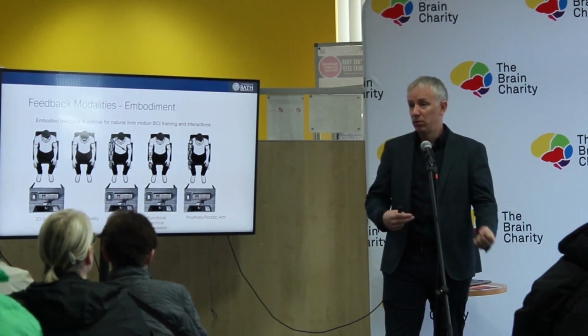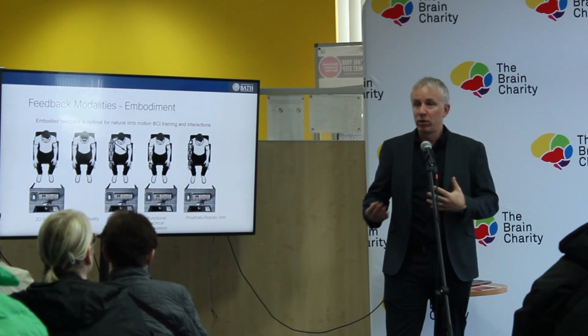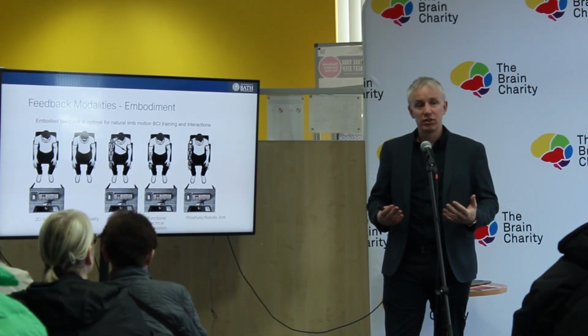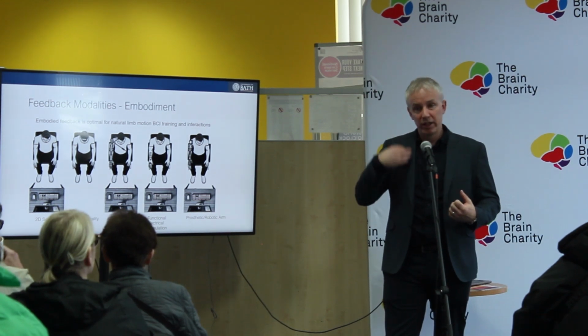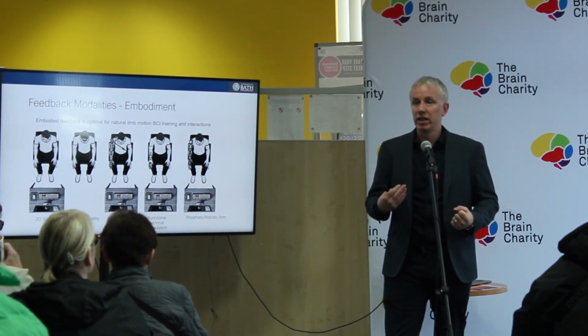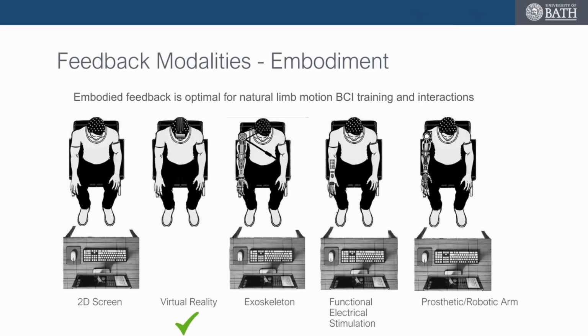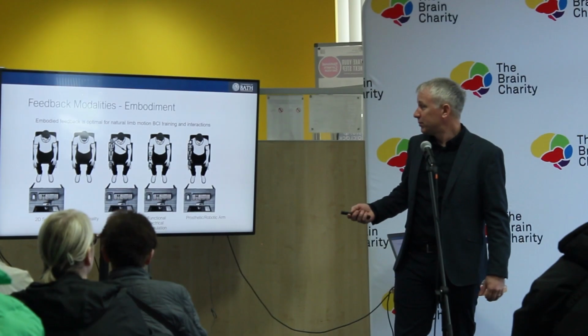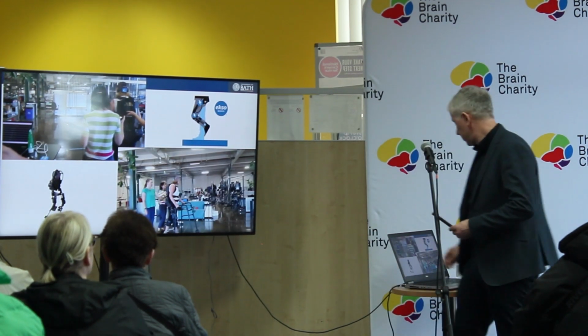And a physio normally moves the hand in a stroke rehabilitation. And people only have a limited access to physios and so on. But if you repetitively engage your brain after a stroke, you can regain that function. And the more you engage, the more likelihood you are going to regain the function. So it's quite important. And so we can hook brain-computer interfaces up to robotic devices.